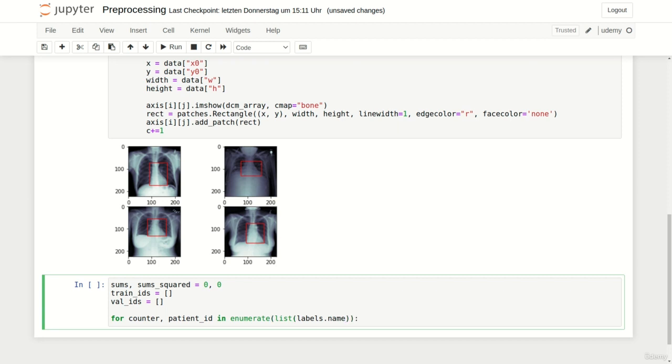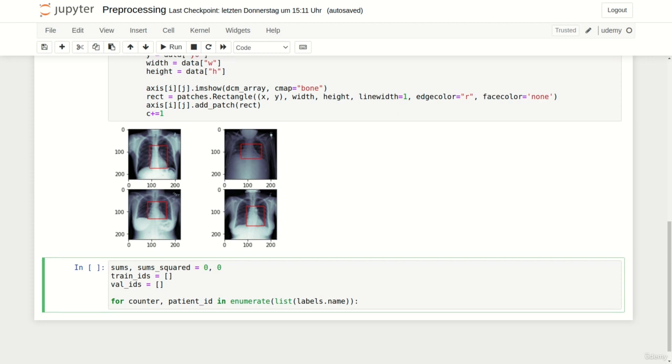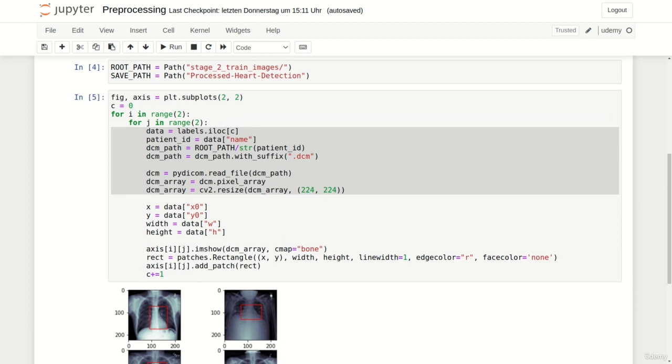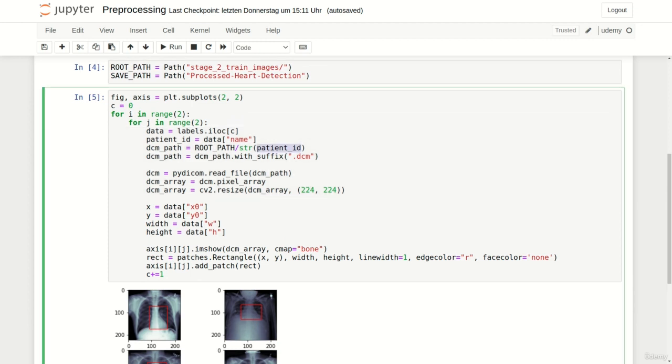We loop over all patient IDs in our labels file. The first steps we have to perform are to create the path to the DICOM file and add the DICOM suffix. Moreover we should read the file with PyDICOM extract the pixel array and resize it to 224 squared. We can directly copy those steps from our visualization routine above.